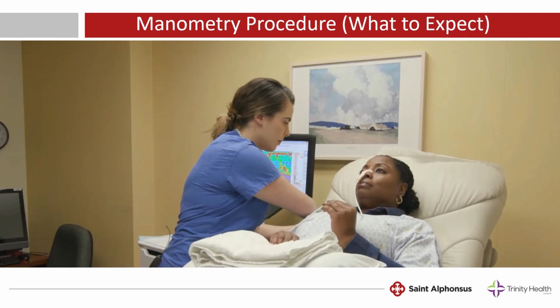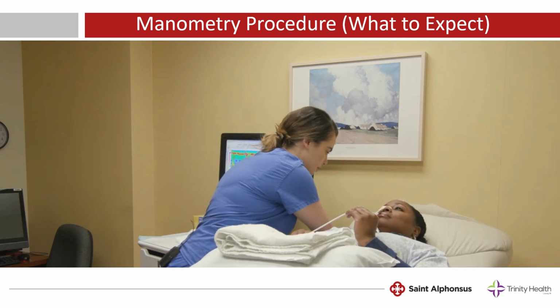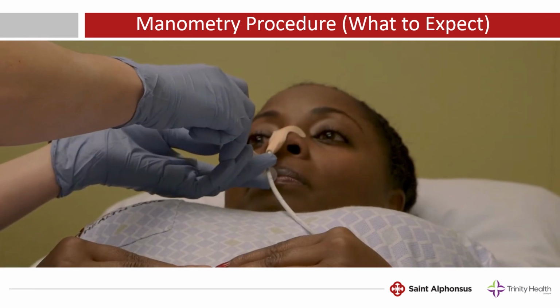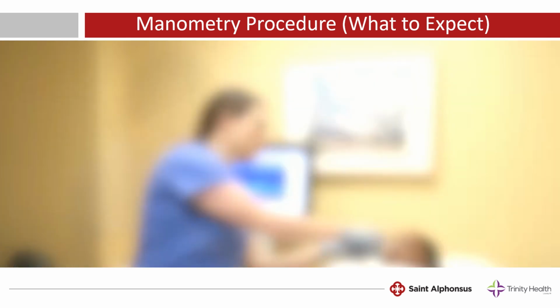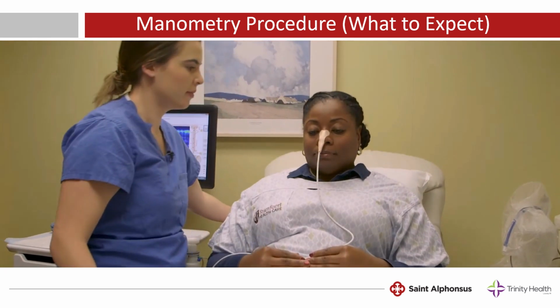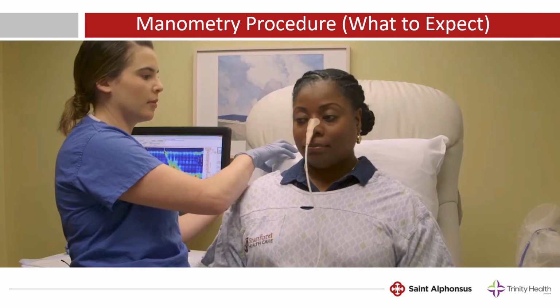Once the catheter is in place, the nurse will lie you down almost flat, will give you small sips of fluid to drink at a time. Your nurse will also instruct you when to swallow and then when not to swallow. They might also have you sit upright for some additional swallows during the procedure. If there are certain foods that trigger your symptoms, your clinician might also suggest that you bring these in.